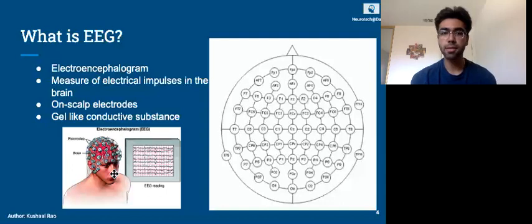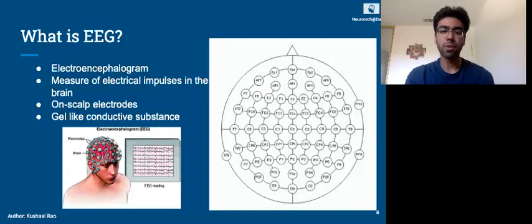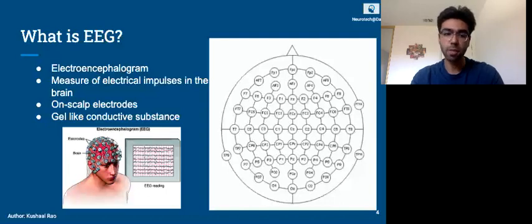Also, another thing to make note of is that the brain is an electrical organ. Whether or not you're doing something intentionally, or you're just sitting there, or even sleeping, there are electrical signals being released all the time. So this technique is most advantageous when you use it paired with a certain controlled stimulus in a controlled experiment. And here's what I mean by that.